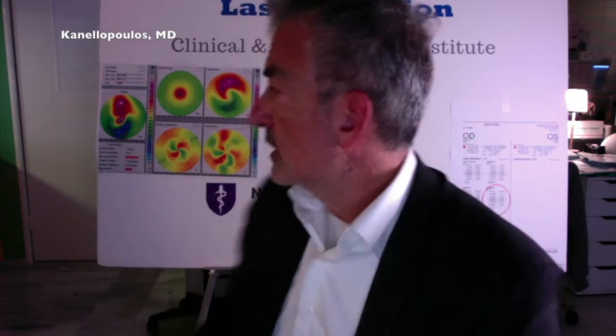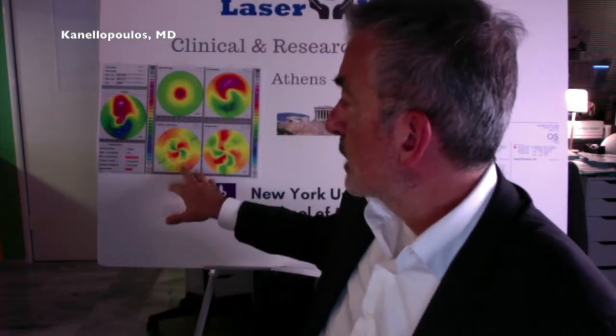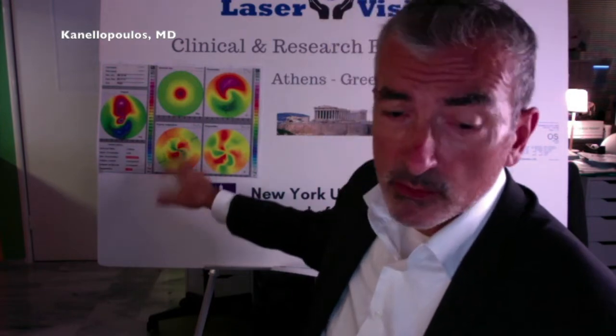And we will see how we analyze the irregular astigmatism with Fourier analysis in order to better isolate the regular part of the astigmatism of this patient. Without further ado, I will go in and narrate to you the actual calculations and the procedure itself, and thank you in advance for your attention to this very interesting case.